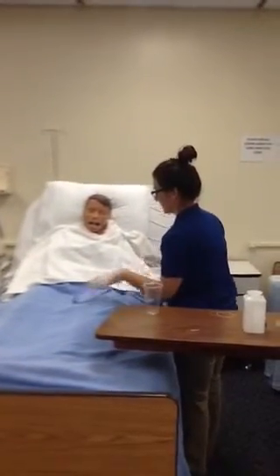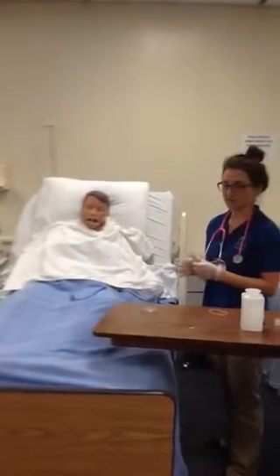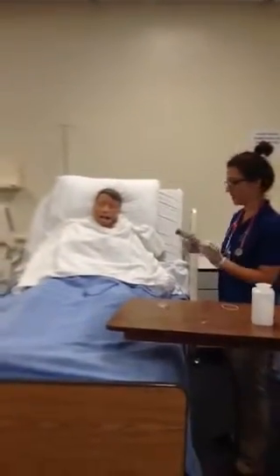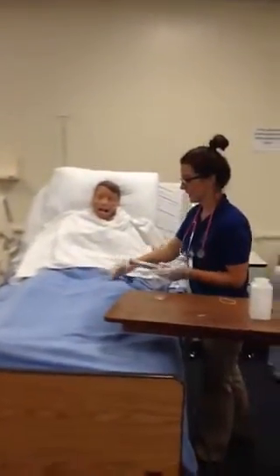All right, so Mr. Wilson, can you speak for me? Yes. Okay, now I am going to aspirate for 30 milliliters of gastric secretions.